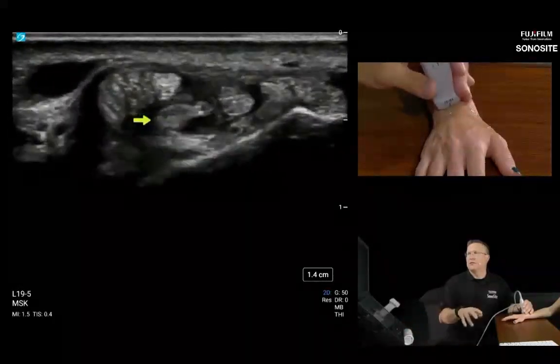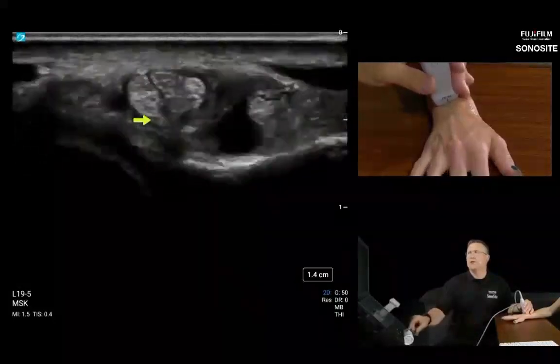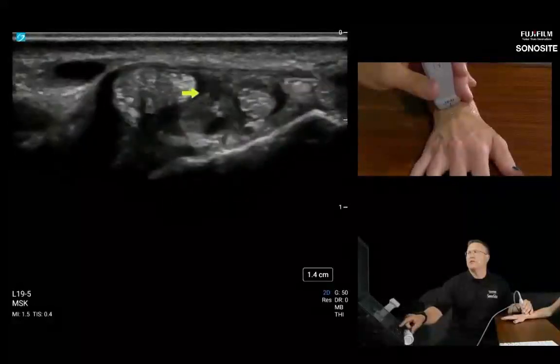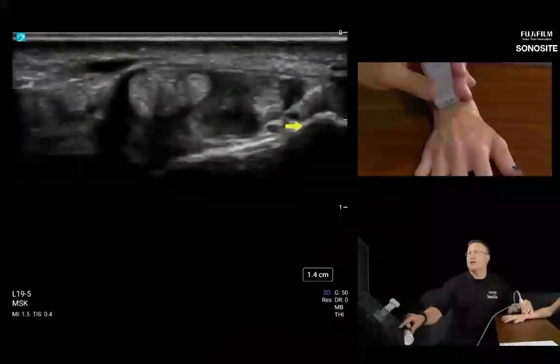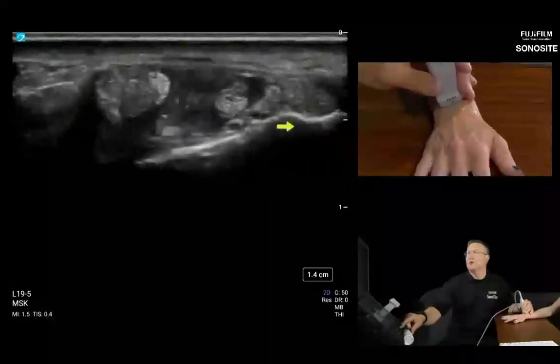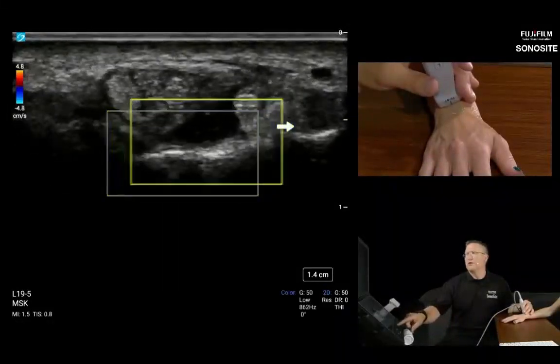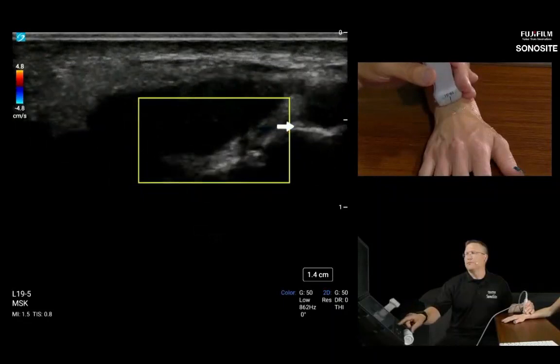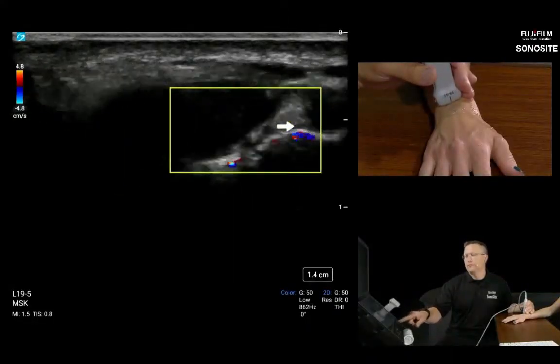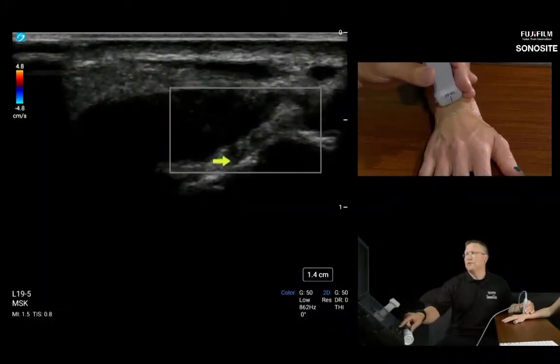Let's wiggle the fingers. When you're scanning this, patients really love this view because they can see their fingers wiggling, they can see the tendons activate. But what's even really cool here is you can see these tendons grinding on the neurovascular structures of the posterior interosseous nerve distally. So let's go ahead and relax. I'm going to throw on color power Doppler, and let's see if we can get the little artery that accompanies the nerve to show up. And there it is. So we have the artery first, nerve second, right here.